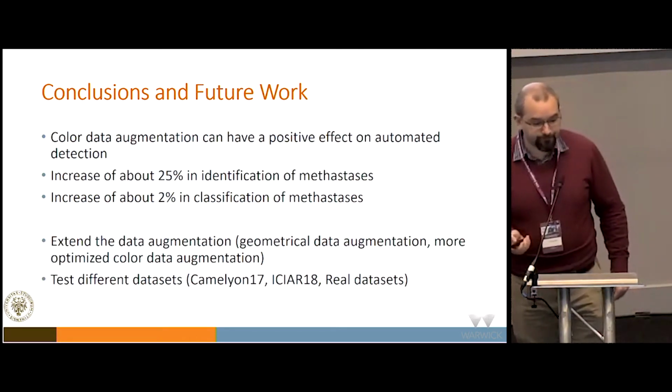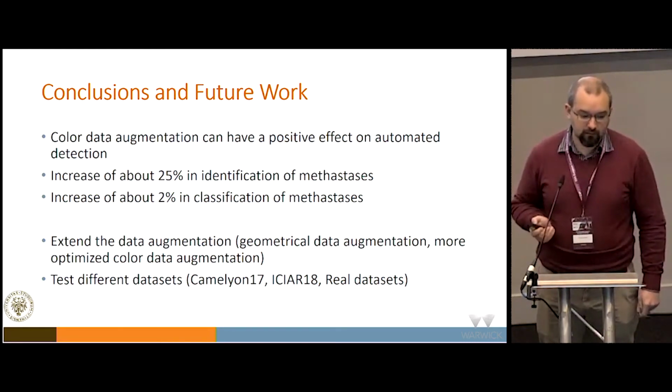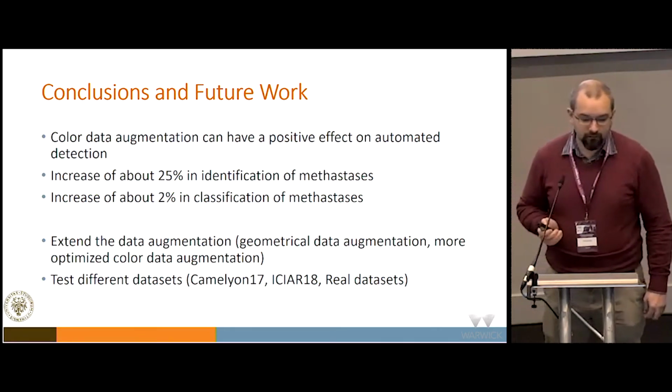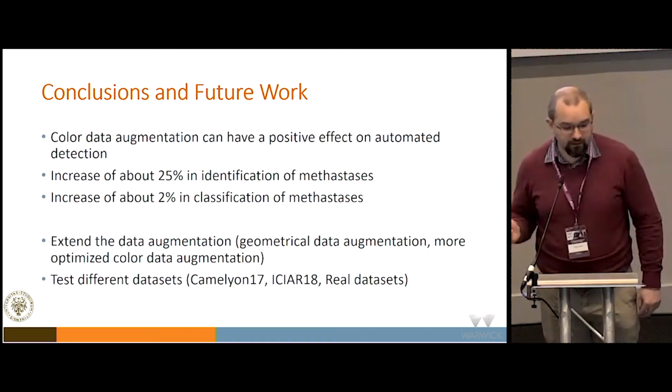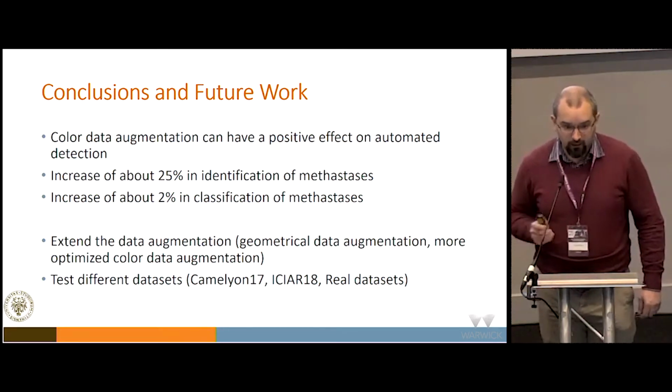To conclude, we could see a significant increase in the score for the identification of metastasis, and also a small increase in the classification of metastasis.